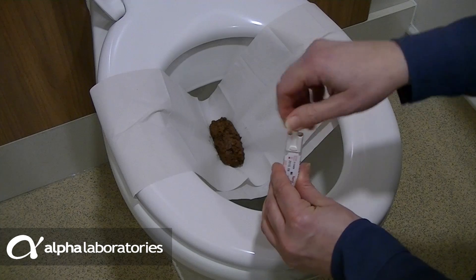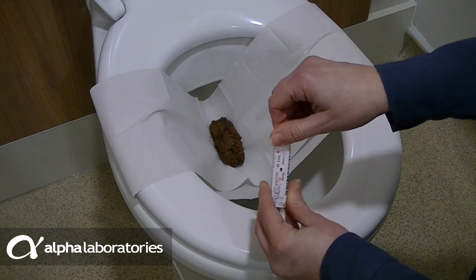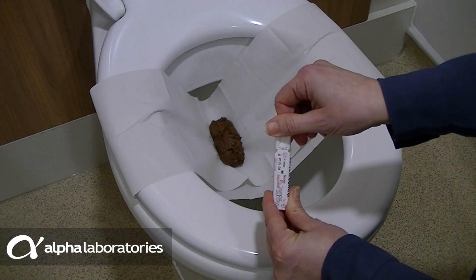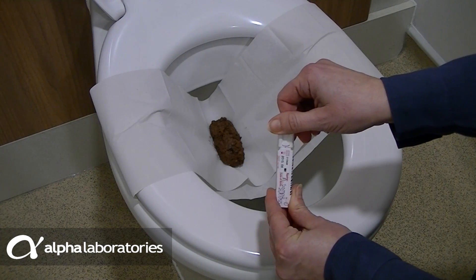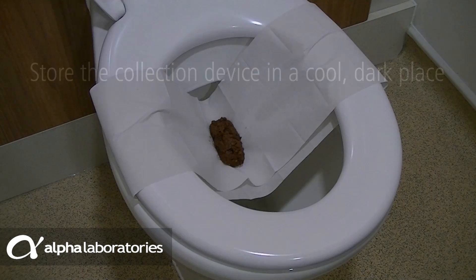Insert the stick carefully and slowly back into the tube. Twist and turn the cap clockwise until firmly sealed. Do not remove the cap or repeat the collection step again, as several faecal collections could lead to a false result.